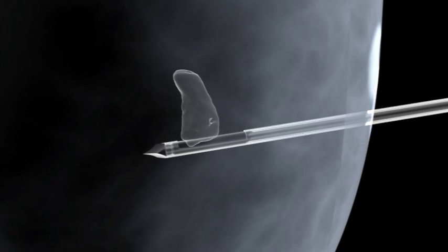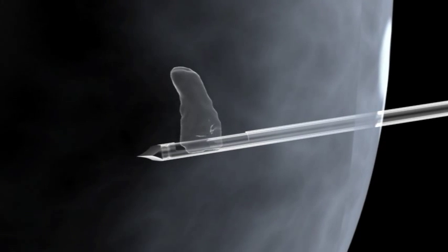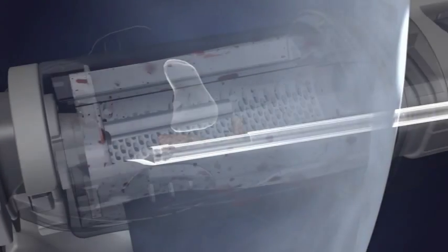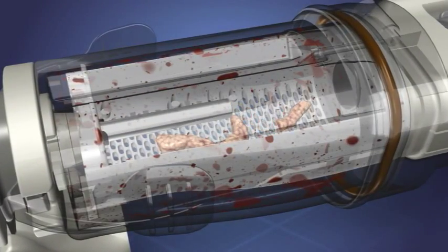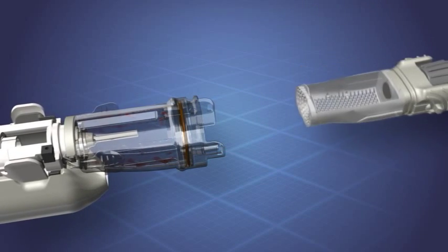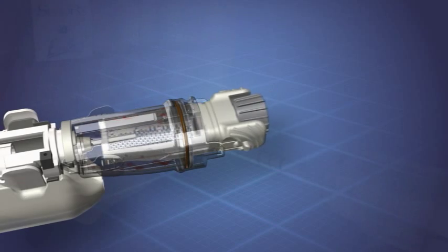The Encore MRI features a truly closed system. Samples are acquired through the probe and automatically transferred out of the breast into a collection chamber. Individual samples, however, can be retrieved during the case for further inspection. Once the samples are collected, the Encore MRI probe is removed from the cannula.